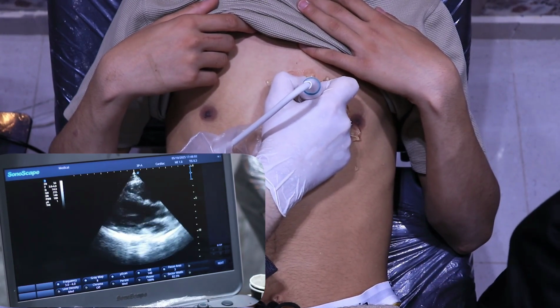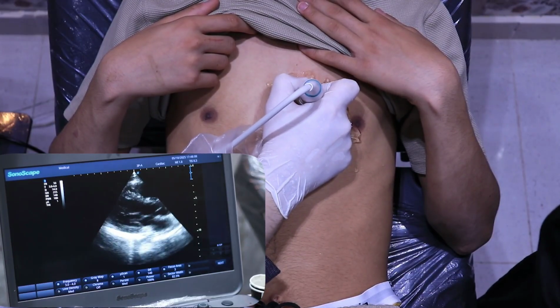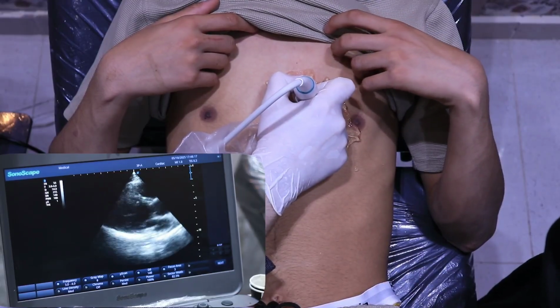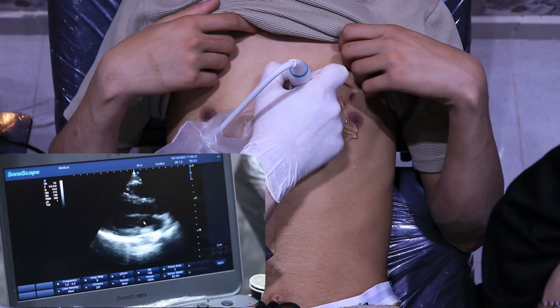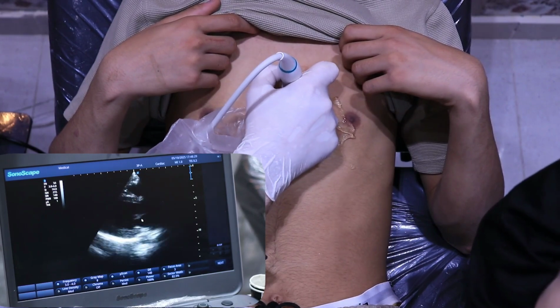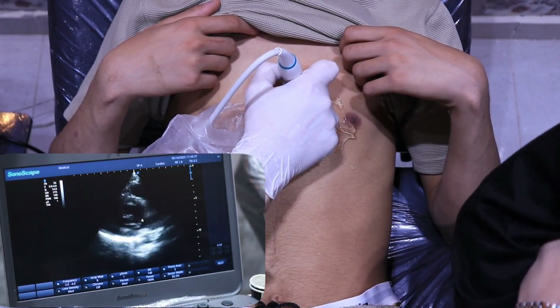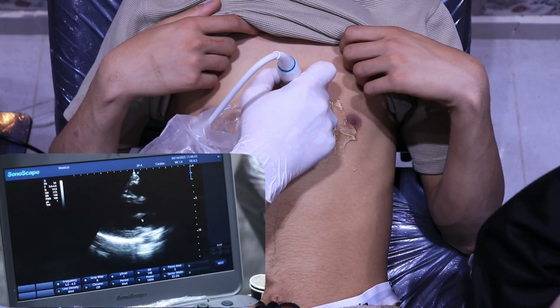Of course, if the mitral valve... you can see here the mitral valve. That's a very good question, doctor. You can see here the mitral valve. Where is the pointer? The pointer, the cursor. Okay, pointer. So the mitral valve, as you can see, has two leaflets, the anterior and posterior. So if, for example, the anterior leaflet is tethered or fixed or stenosed, if the mitral valve is structurally abnormal, that means there is a restriction of movement irrespective of the LV, right? So we only use the EPSS if the mitral valve is structurally normal.